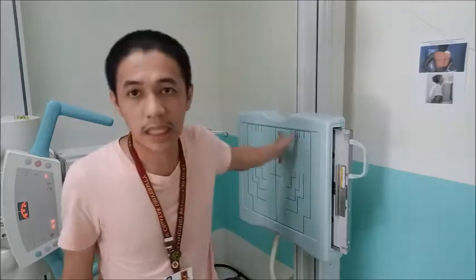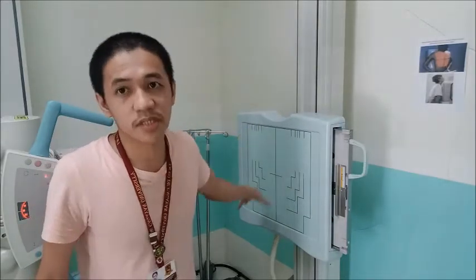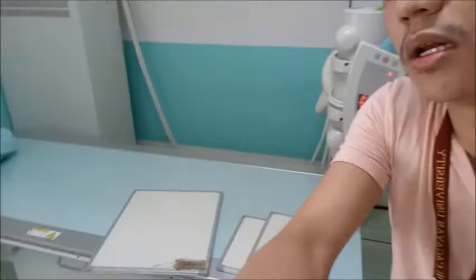Okay. Some pediatric patients, especially those below 5 years old, cannot stand on the chest bucky or the chest stand by themselves. If that happens, just have them lie down on the radiographic table.